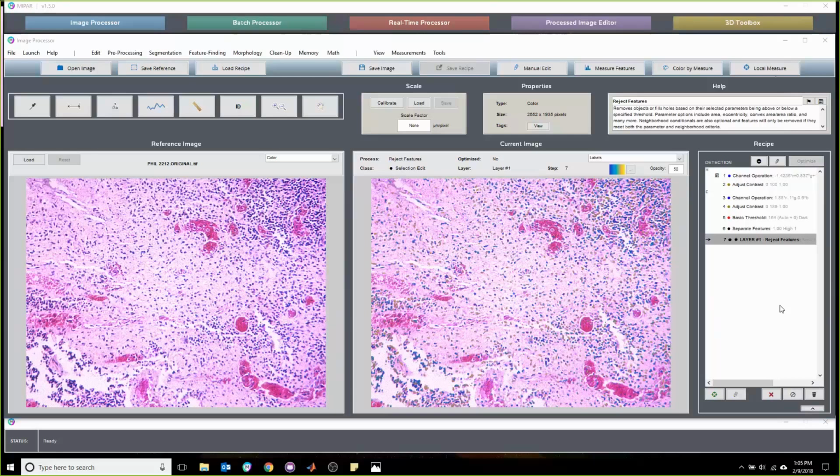So, like you mentioned, for now you could even submit to us the raw RGB image, and even masks of the tracings that tell us exactly what features you would like your deconvolution to be based on. And we can then turn around a recipe in a few minutes for you that has those channel operations in there, and now you're good to go. And if you only use those 2 stains, you'll probably never need another deconvolution ever again.